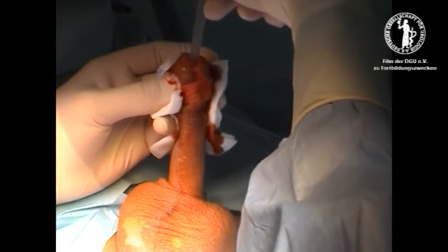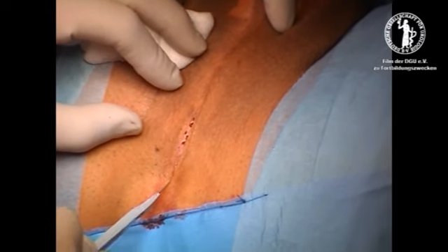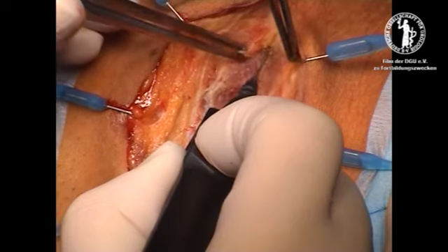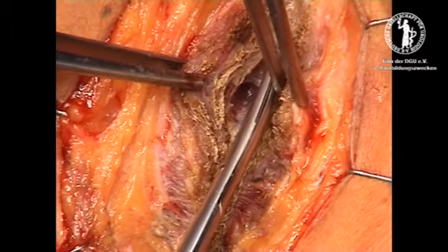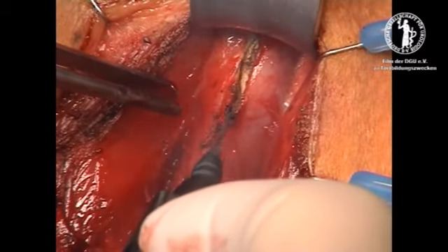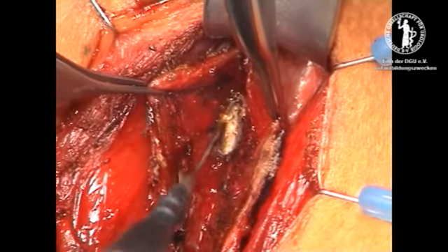A 20 French single-use catheter is inserted till to the stricture and can be palpated perineally. Opening of the stricture until both ends are wide enough for a 30 French bougie.